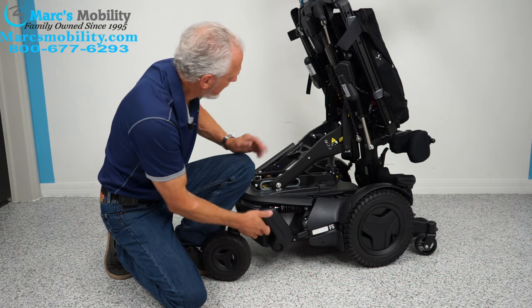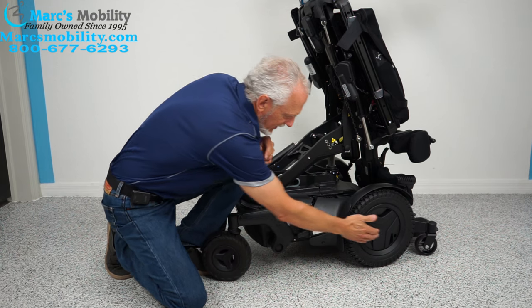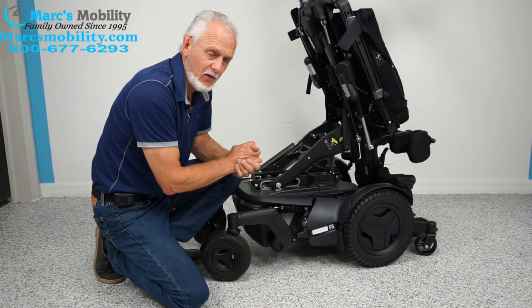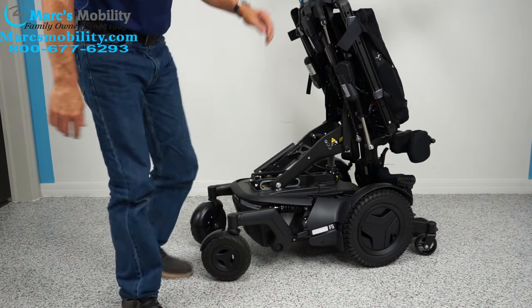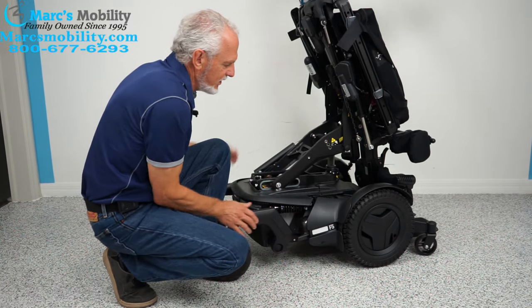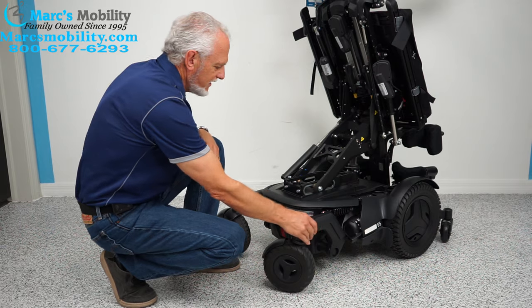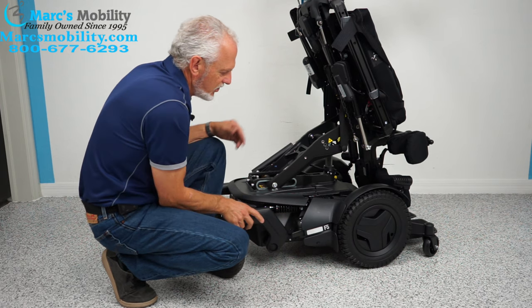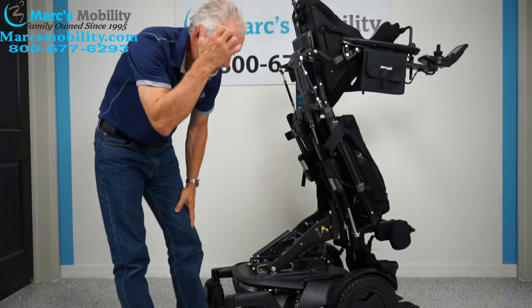You have four anchor points total and a motor that drives directly to the wheel. This chair weighs about 450 pounds, so you can't just push it. If you need to roll it, turn the power off, push the lever down to unlock the wheel — do both sides — then you can roll the chair. When you're done rolling, make sure you put it back in gear. It's so well constructed, that's why it's so heavy.